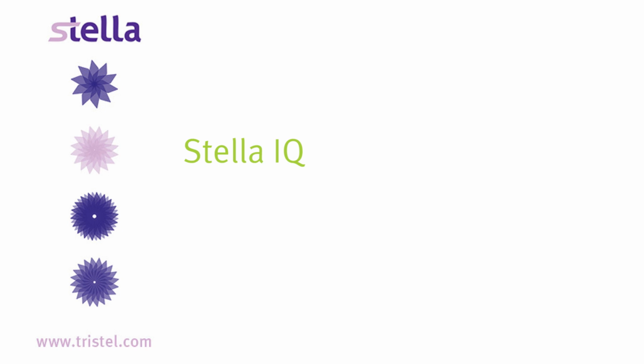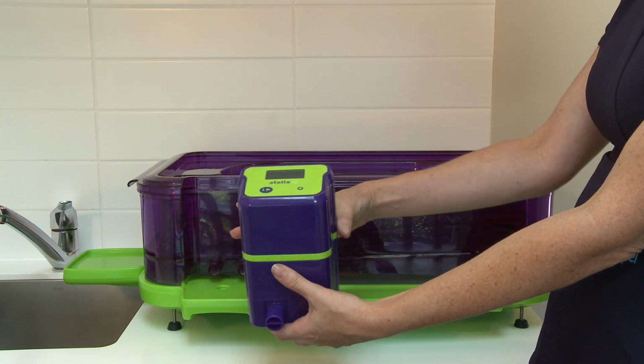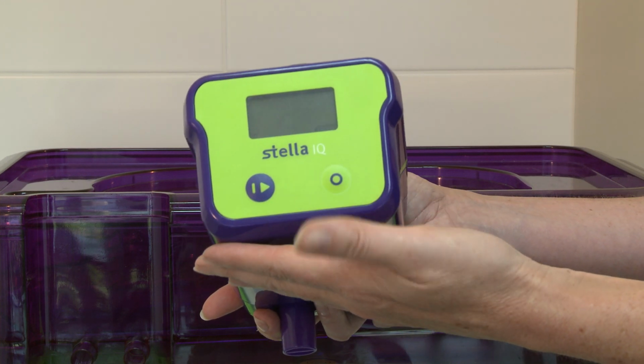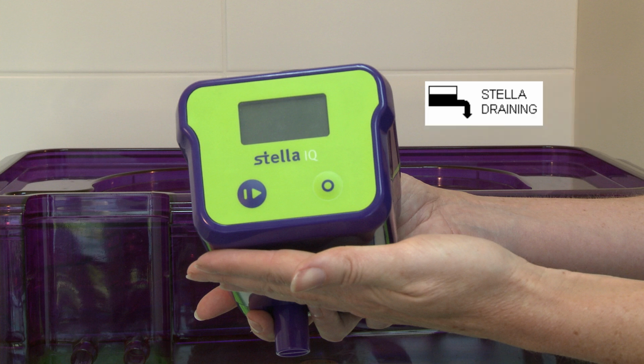Stella IQ. Stella IQ is the controller of the disinfection system. It has 2 buttons: the on and OK button, and the off button. This small battery-powered controller contains software that displays prompts on an LCD screen directing the user through the stages of the disinfection cycle. It has a timer to manage the contact time of the disinfectant with the instrument. It records details and all required steps of the disinfection cycle. Stella IQ provides a validation code to confirm a successful disinfection cycle. This validation code is recorded for audit trail purposes and can also be downloaded for electronic records via software.